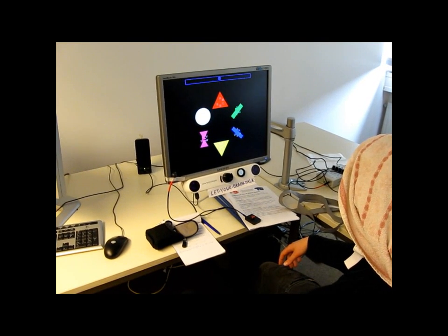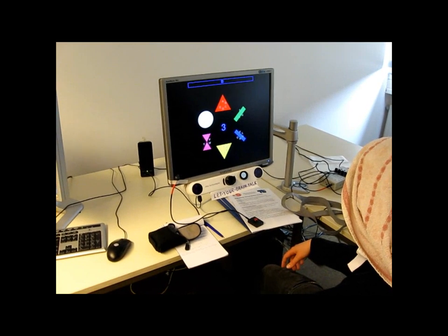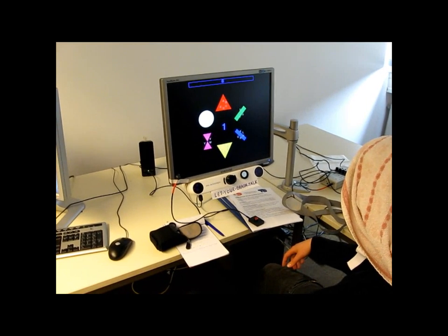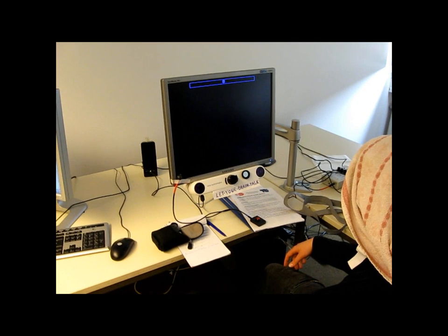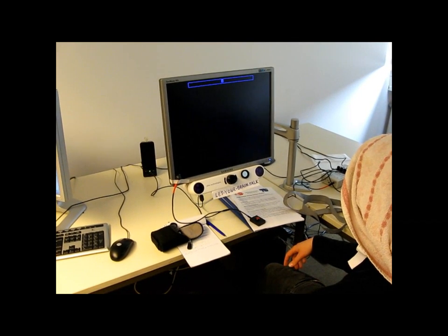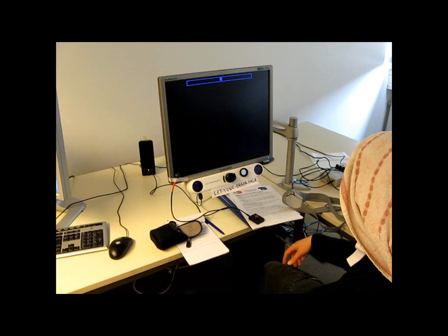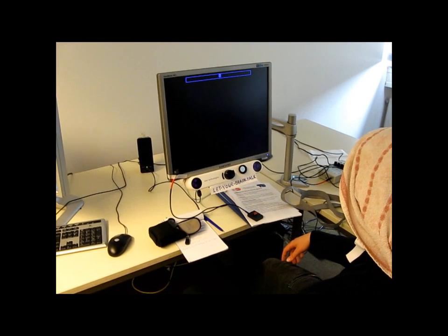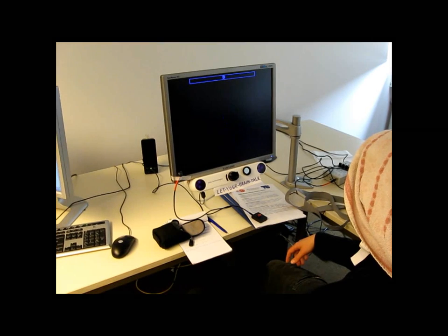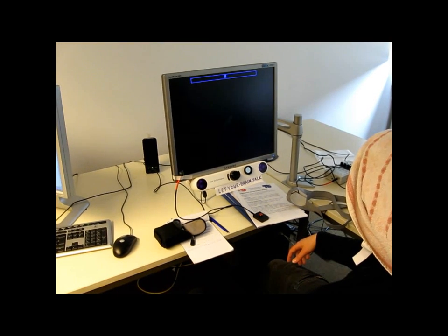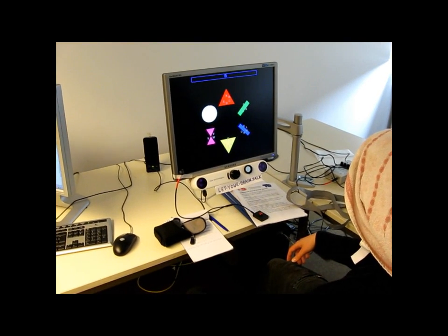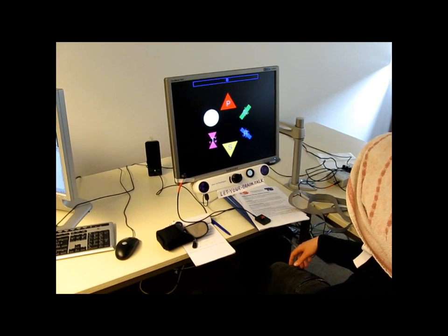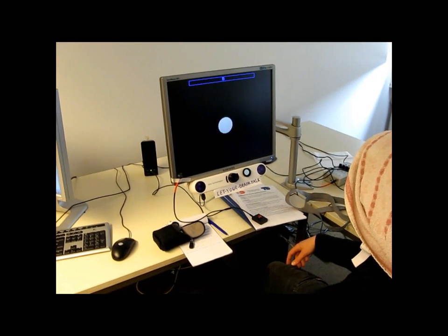So, as you can see I picked a B, and we're continuing, you can see I'm not moving anything at all, so I have to pick something that contains my letter, one of those groups, and once the computer is sure that I made a decision on a specific thing, by noticing an increased activity multiple times for that specific symbol.